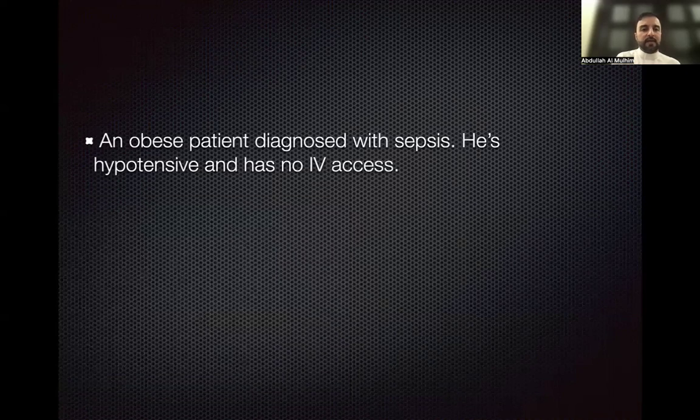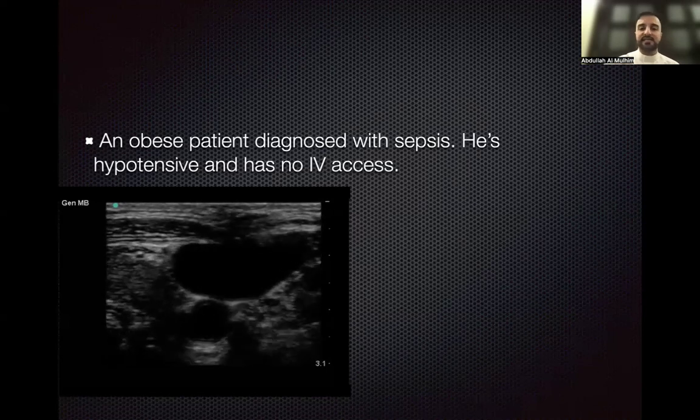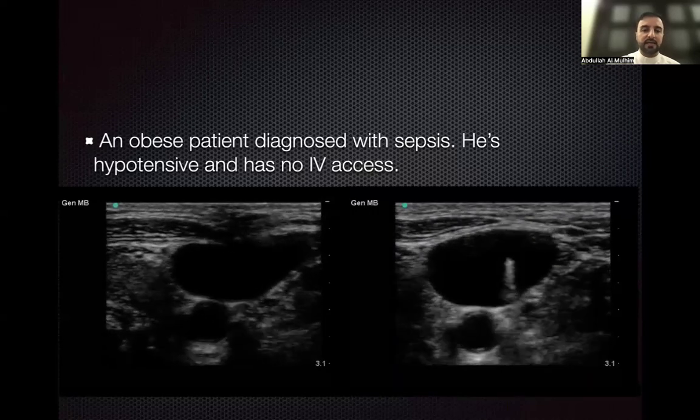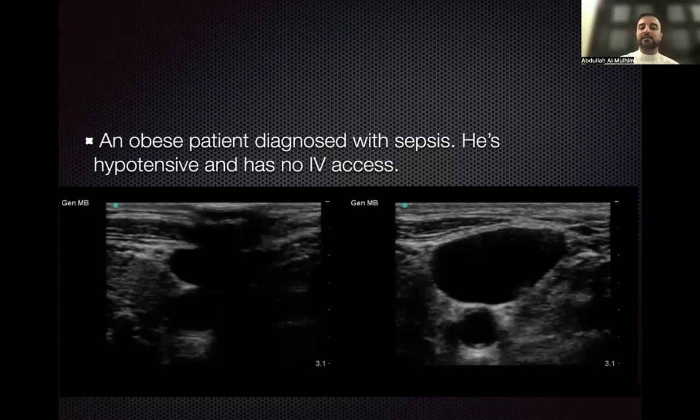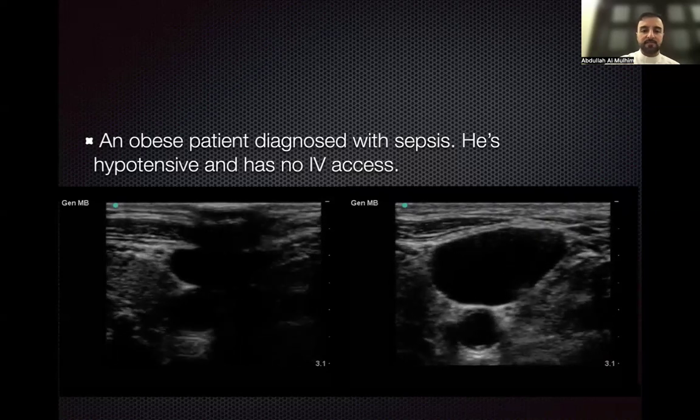Okay, so one of the frequent dilemmas that we are having in our emergency, somebody who's a bit sick, maybe septic shock, for example, a very difficult line, because of the anatomy, because of the small veins, or you want to start any pressors, and there is no IV access or very small IV access, definitely need a central line. So definitely ultrasound right now is the standard of care for any central line insertion. So it can help you while you are doing an ultrasound. So ultrasound right now is the way to go for any kind of procedures usually done in emergency, especially central line.